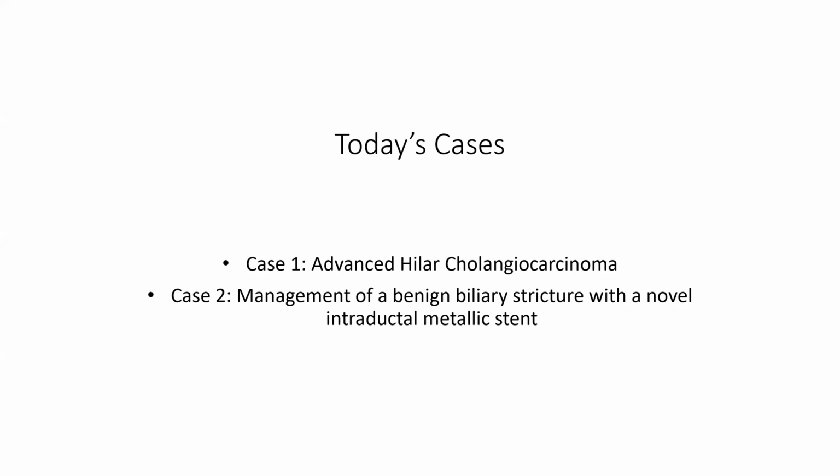So we will watch the approach of Dr. Hani Shihab together. And if there are any questions from the audience, either I or my dear colleague, Professor Dr. Ibrahim Mustafa, will be happy to answer you and to discuss the technique, the prognosis and the treatment of the cases in the second step after finishing the ERCP.